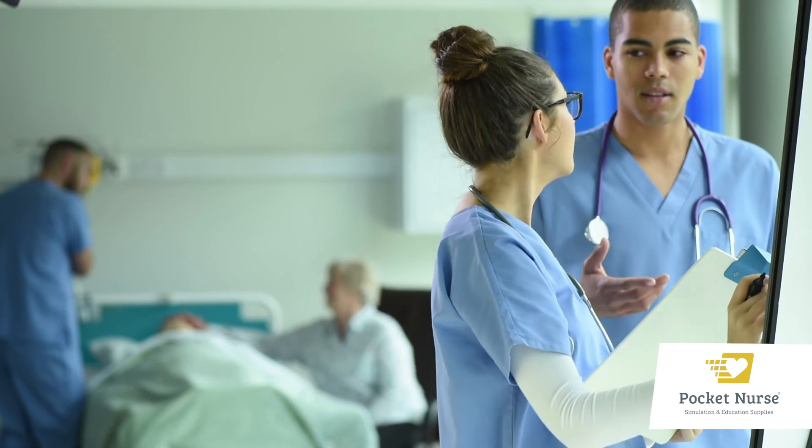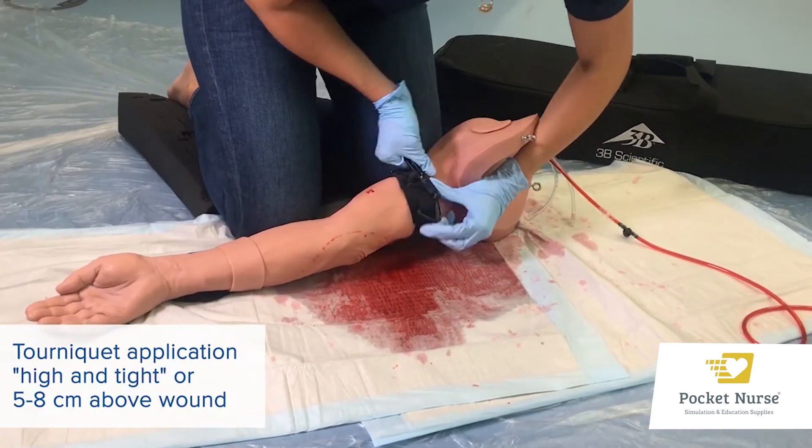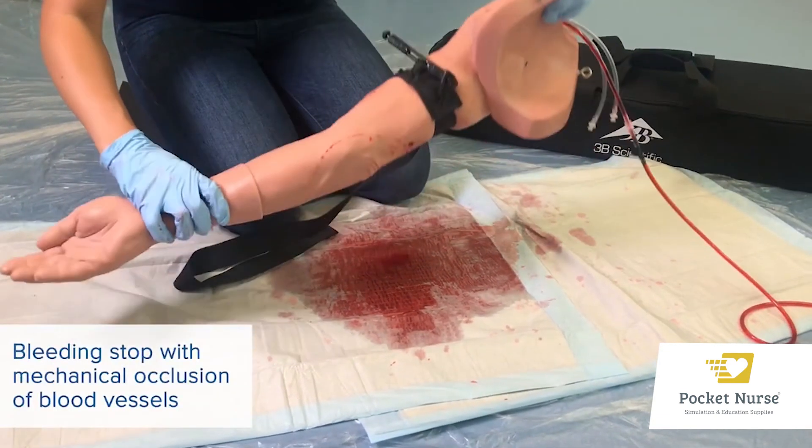Usage of this trainer is designed to help students gain confidence in managing difficult bleeding. Direct feedback is provided to the student by the stopping of bleeding when the tourniquet has been correctly applied.